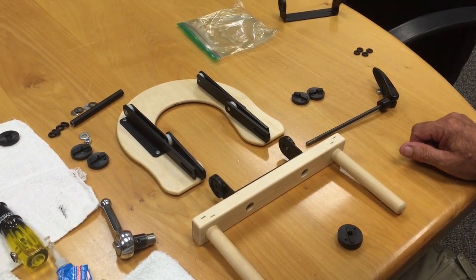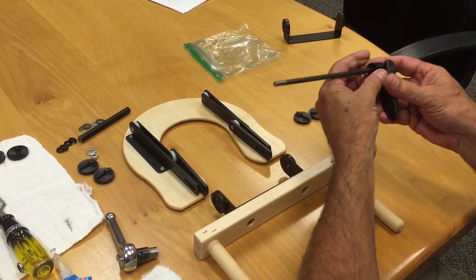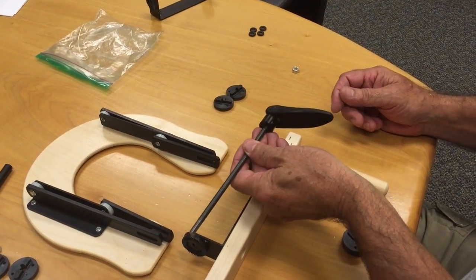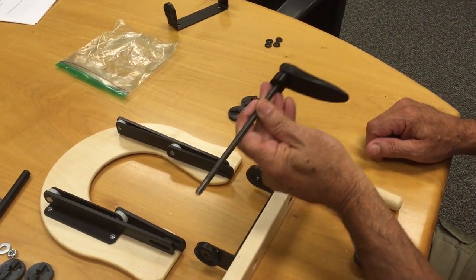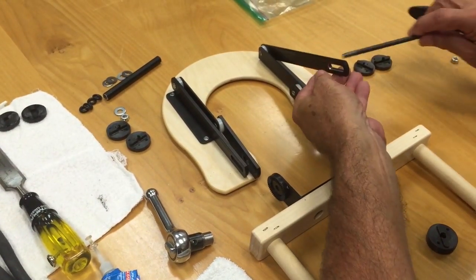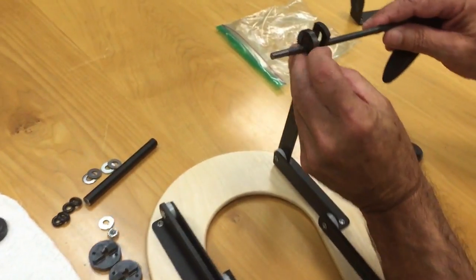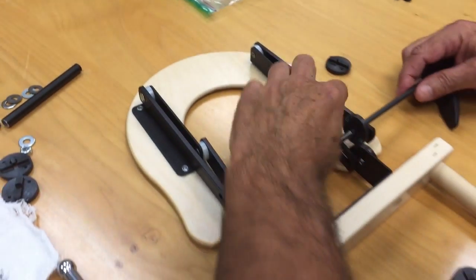Going to reassemble the FaceRest, and we will start with the rod and handle and ensure that your spacer is in place. You can turn this either direction, but to finally get it all the way through and to put your nut on, you will have to have it in this position, and I will show you that during the assembly procedure. First of all, we would put this through the slot, and your disc would ride in there like such.